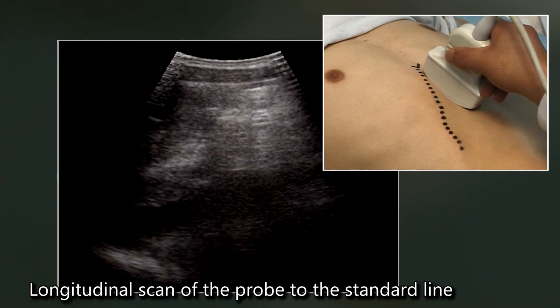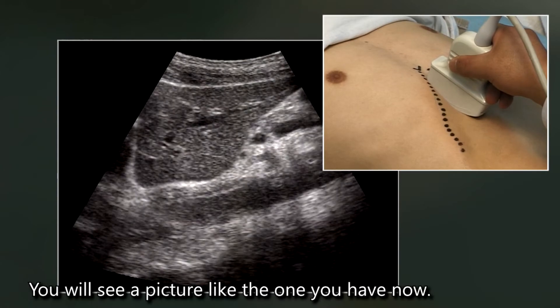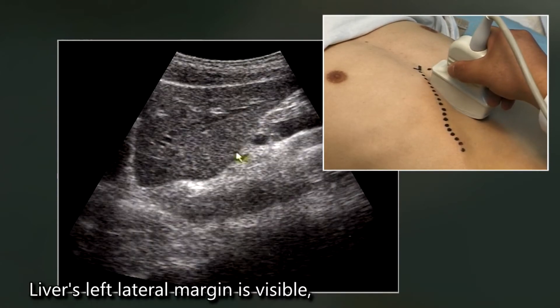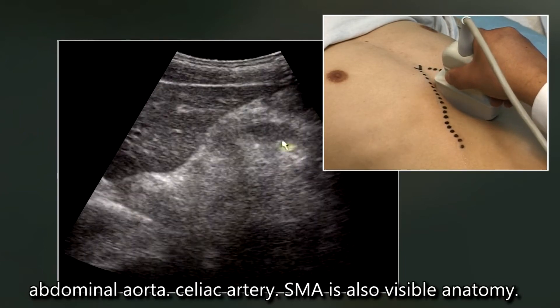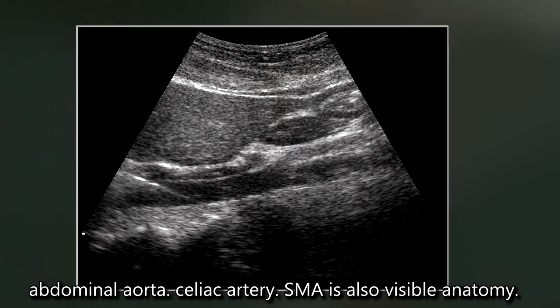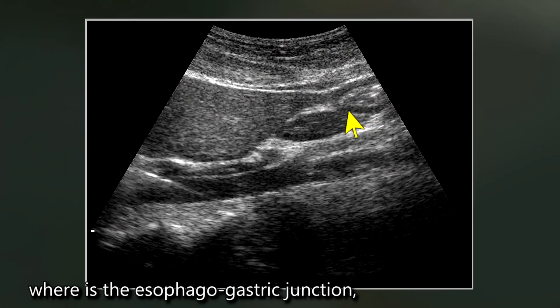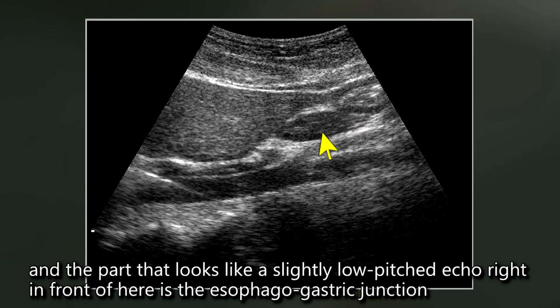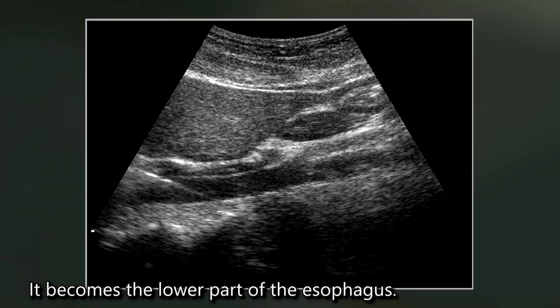On a longitudinal scan of the probe to the standard line, you will see a picture like this. The liver's left lateral margin is visible, along with the abdominal aorta, celiac artery, and SMA — all visible anatomy. Here is the stomach antrum. The esophago-gastric junction is the part that looks like a slightly low-pitched echo right in front of here, which is the esophago-gastric junction.